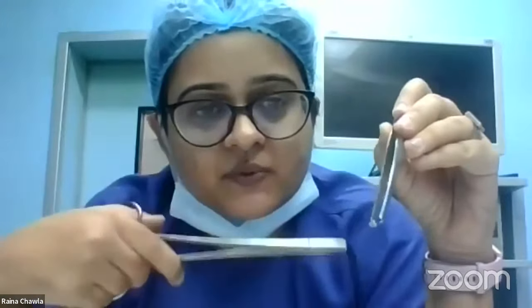Okay, so once the placenta is out, now I need to suture. What do I need to suture? The uterine incision. Yeah, so I have to hold the angles of the uterus with an Allis forceps. If she's bleeding a lot, I have to hold with a Green-Armytage forceps. Okay, so both of them can be used to hold the uterine angles. And then I suture using my needle holder and the forceps. Okay, I suture the lower uterine segment, then I suture the peritoneum, then I suture the rectus sheath, and then I suture the skin.